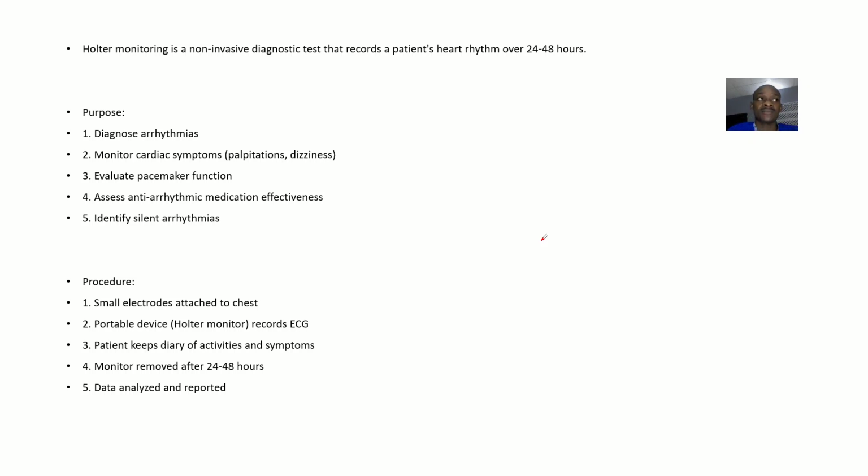So take, we'll read about it and see how it is applied. So I think this Holter monitoring is a non-invasive diagnostic test that records the patient's heart rhythm over a period of what? 24 to 48 hours. The purpose is to diagnose arrhythmias.